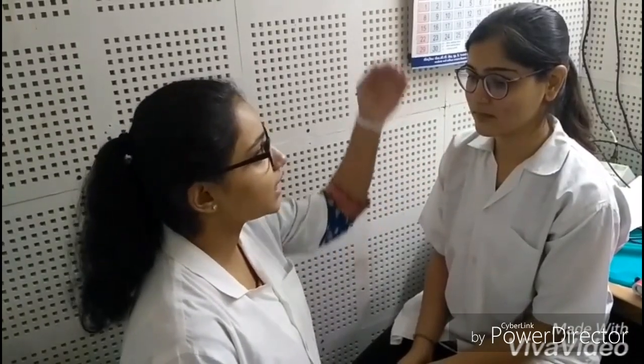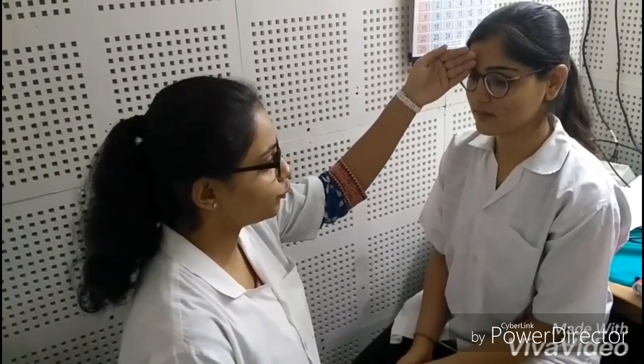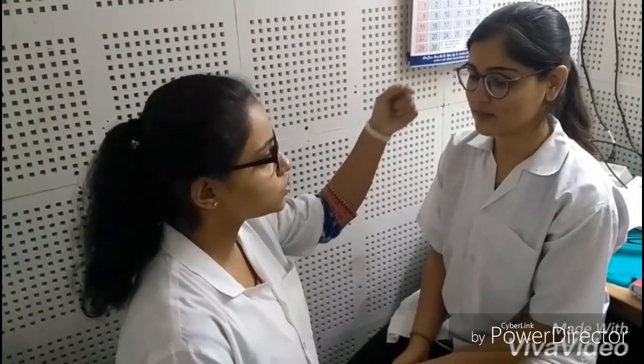Now we are going to demonstrate Weber's test. First, we have to tell the name and procedure of the test to the patient. In Weber's test, we use 512 Hz frequency. We strike the tuning fork on a firm surface like the elbow, knee, ankle, or sole of the foot, and then place the vibrating tuning fork base on the midline — at the vertex, midpoint of the forehead, root of the nose, incisor teeth, or midpoint of the chin.